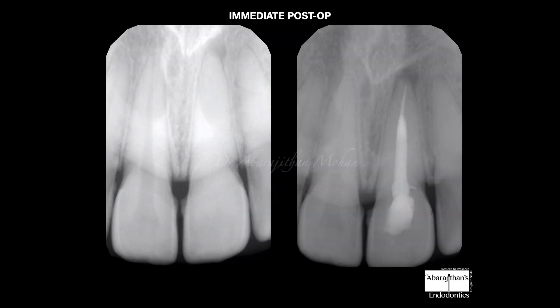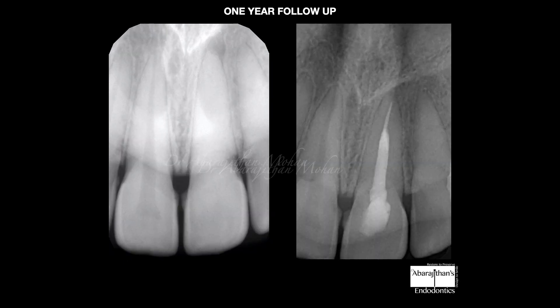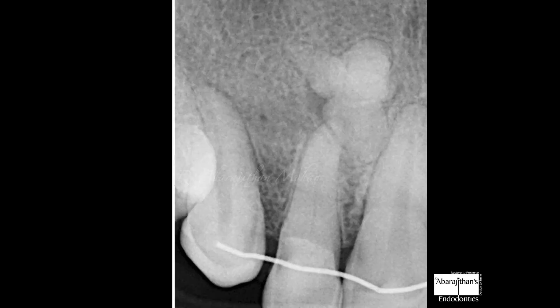So I only initiated treatment in the central incisor and completed the treatment. At the five-month follow-up we can see the lesion starting to reduce in the maxillary central incisor, and at the one-year follow-up we can see a completely healed periapical region. We can also see that the maxillary lateral incisor continues to remain healthy. This case is a very nice explanation for understanding how we manage these calcified cases.